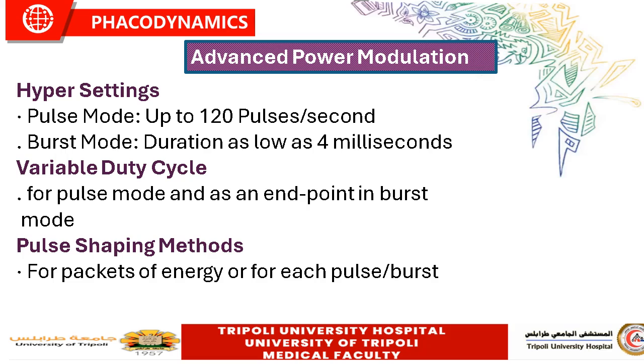refined. But with the trend towards small incision cataract surgery or micro incision cataract surgery, and the need for very safe energy expenditure and very safe phaco procedures, further refinement of this ultrasound modulation was needed, and the advanced power modulation developed, especially after understanding the role of the duty cycle.